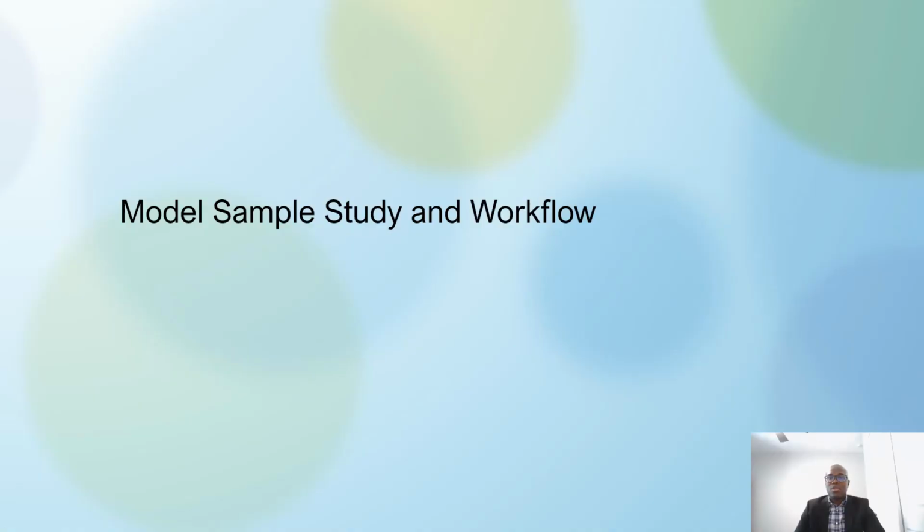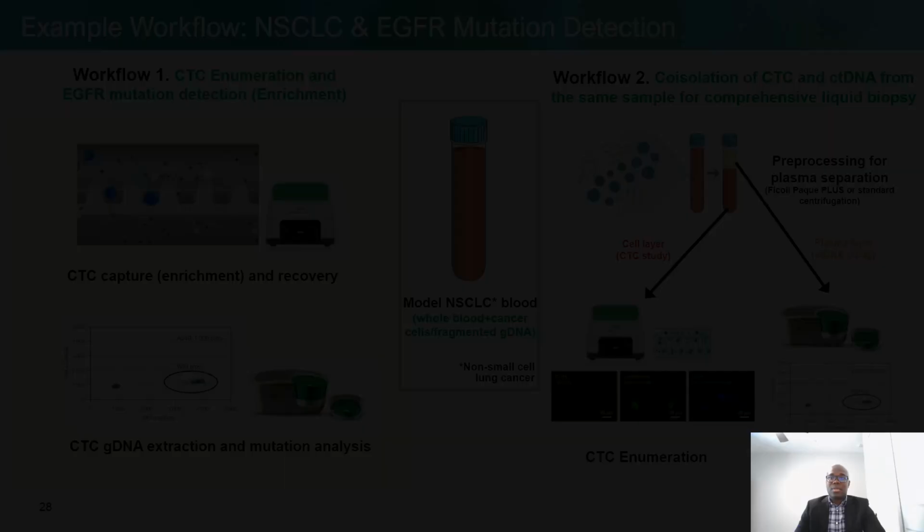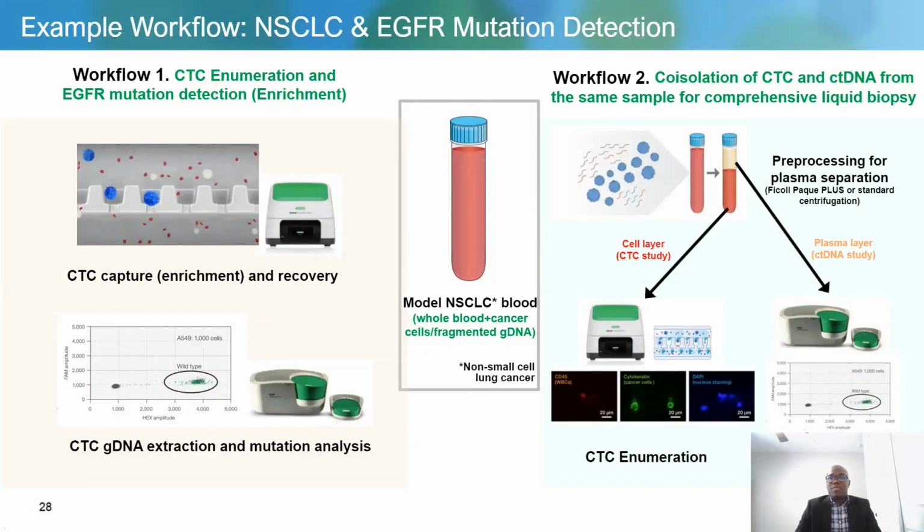So now we go on to talk about a model sample study that we carried out and the workflow that was used. In the workflow being introduced subsequently, we demonstrate a protocol that shows CTC enrichment and EGFR mutation detection, and also the dual isolation of ctDNA and CTCs from the same sample.